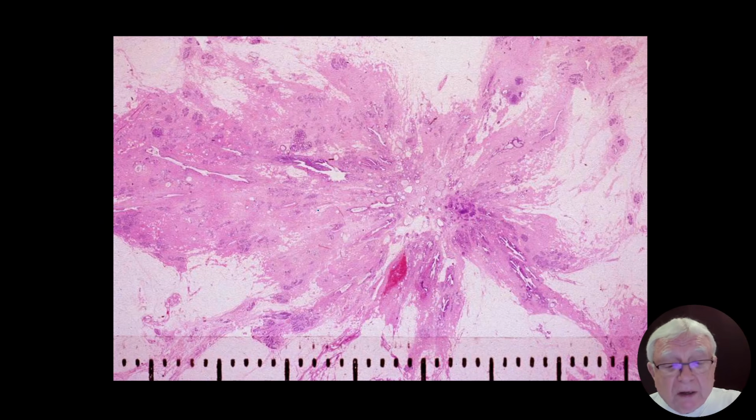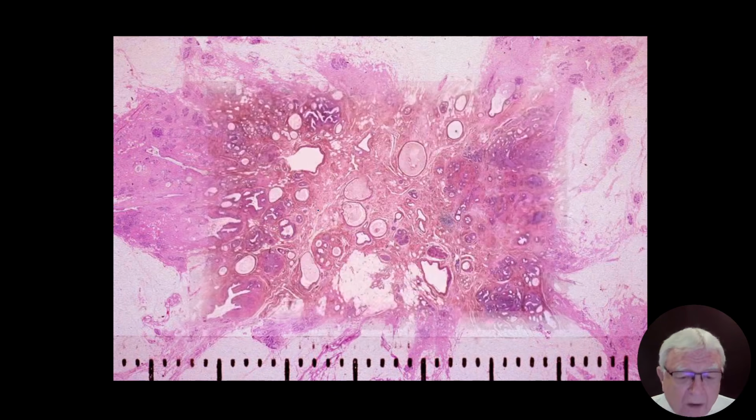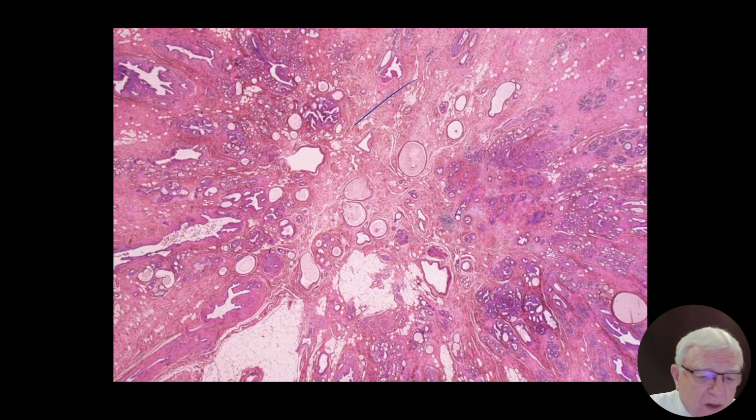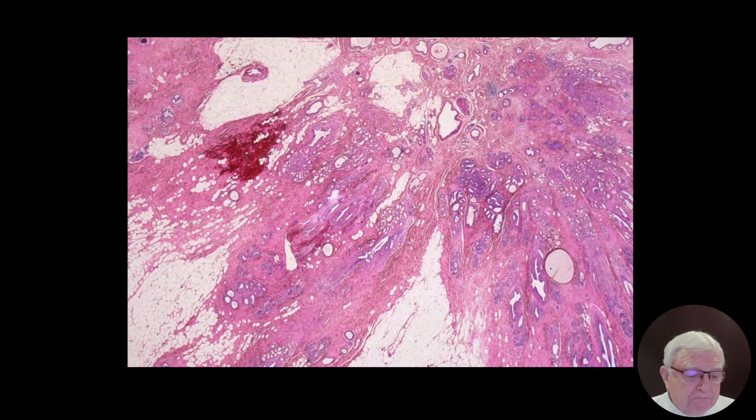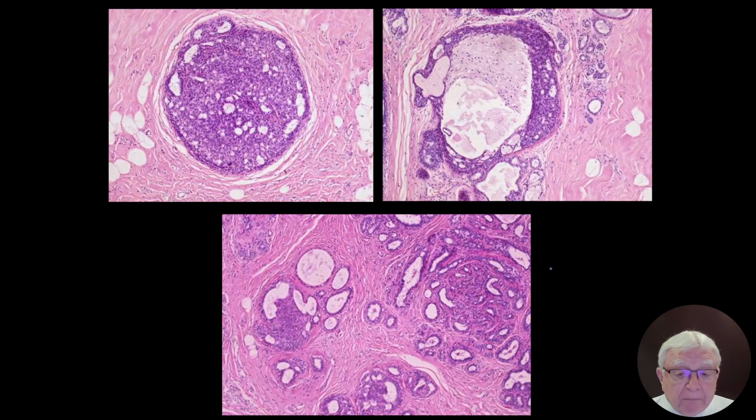I'm very sorry. The powdery calcifications and the radial scars are quite a nuisance, quite a lot bother us. You see the central portion where you put the needle, there is just fibrosis. The more you go to the periphery, the more cells. That's why, unfortunately, we have to take out the whole thing.